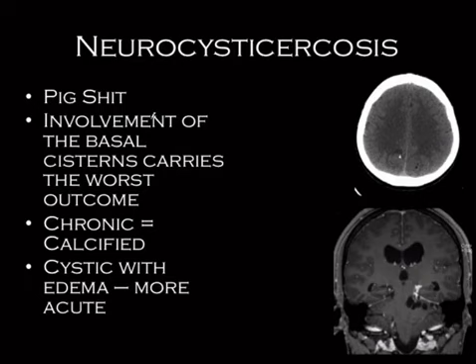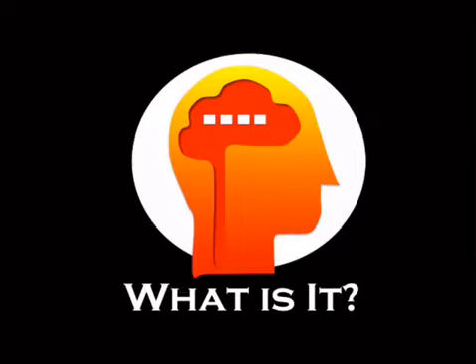So if I was a betting man, really you could show it either way. A whole bunch of holes in the head, like punched out holes in the head, would probably be the most likely way it would be shown. The second most likely way would be calcs, and probably more than one. Probably a whole bunch of different calcs. And they may tell you the guy's a Mexican pig farmer or something like that. That would be a good giveaway if you're lucky and you get any history.